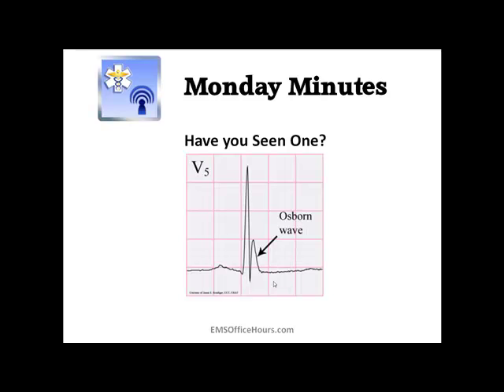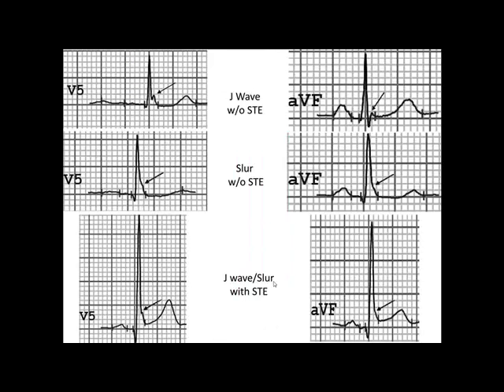Here's another quick picture referencing the J wave and ST elevation. I've got some V5 shots here showing the J wave without ST elevation — you can pretty clearly see it there. Now here is what they call a slur — you can't really see it all too much, but if you look really closely you might be able to kind of make it out. And then the J wave with the slur on the bottom you can make out here in V5, with ST elevation.